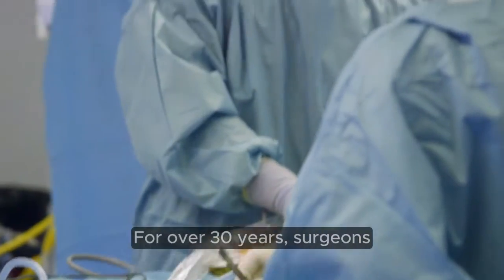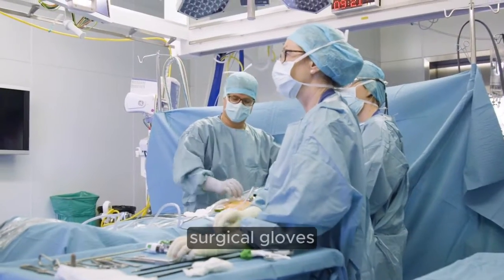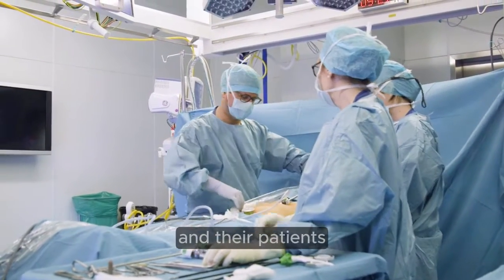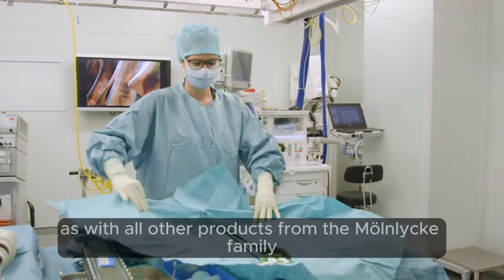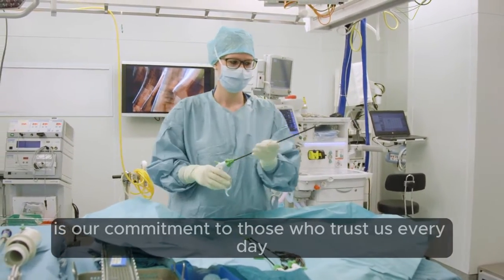For over 30 years, surgeons and healthcare professionals have trusted the premium quality of Biogel surgical gloves to deliver the best possible protection to them and their patients. As with all other products from the Mölnlycke family, our commitment to quality is our commitment to those who trust us every day.